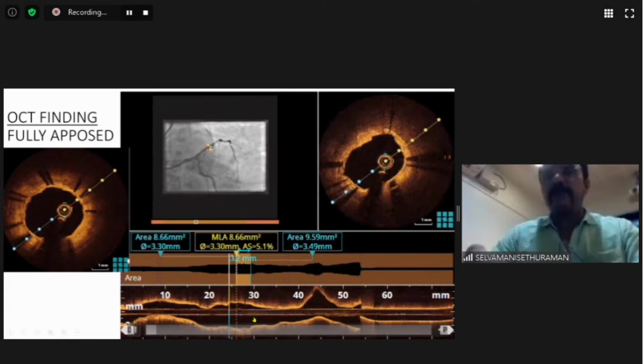And this patient had almost late stent thrombosis. You see, this is the angiogram after an episode of ST elevation in the anterior leads. This stent was put almost 8 to 9 months back. And this is the finding. So when you see this, generally without imaging, we would have just, see, this is the angiographic finding after thrombosuction. And you see that the stent is there.